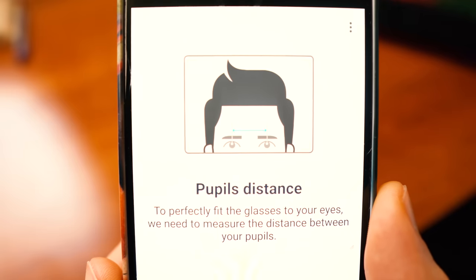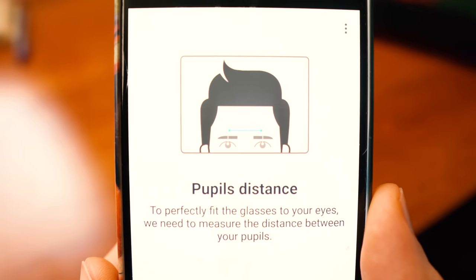A major part of ordering glasses and getting accurate eyeglasses — ones that you can see out of and are comfortable to wear — is having an accurate pupillary distance, also known as your eyeglasses PD. In this video, I'm going to show you how to measure your pupillary distance for glasses at home using a free and simple app on your phone.